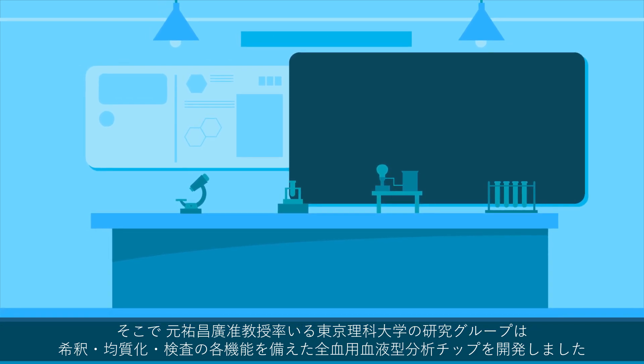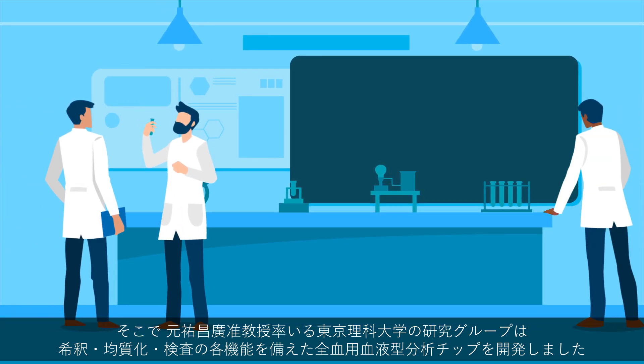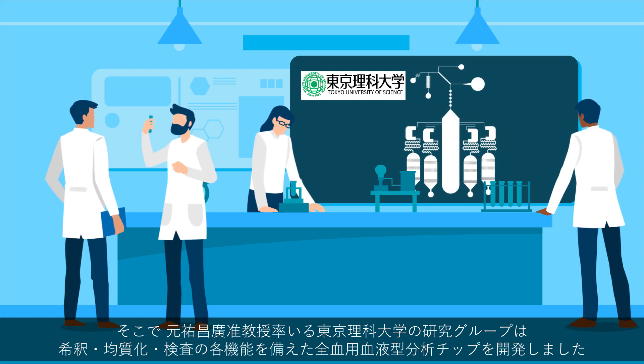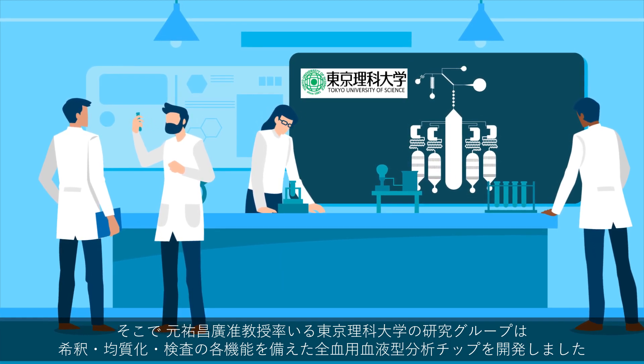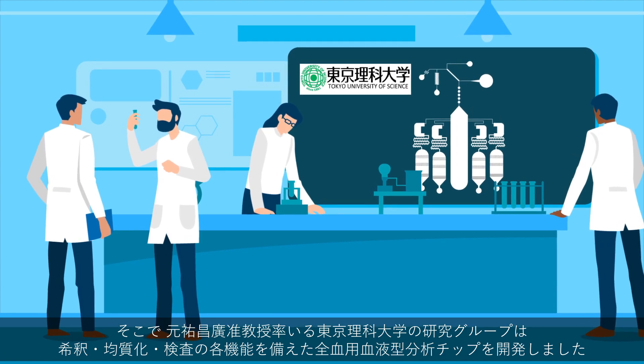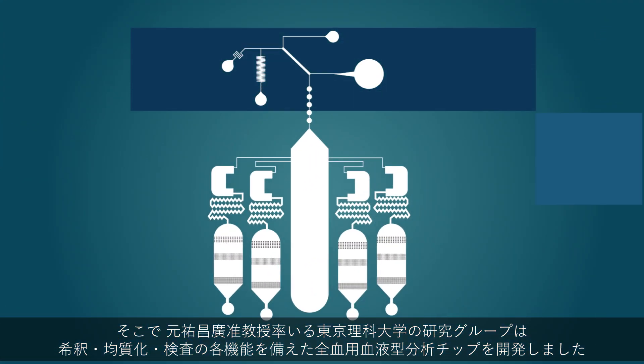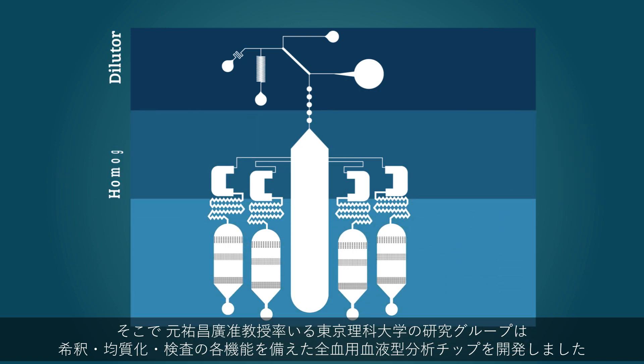To overcome this issue, Dr. Masahiro Motosuke and his team at Tokyo University of Science have developed a compact and rapid blood group analysis chip for whole blood, which contains a micro-sized laboratory with three main segments: the diluter, the homogenizer, and the testing chambers.